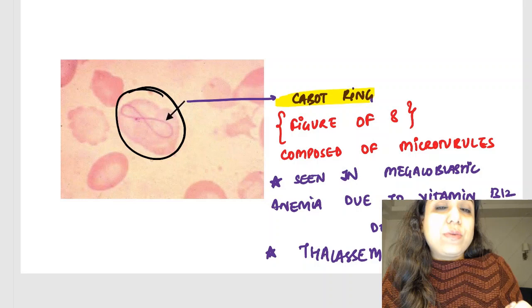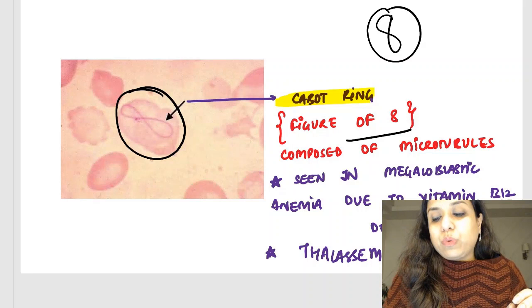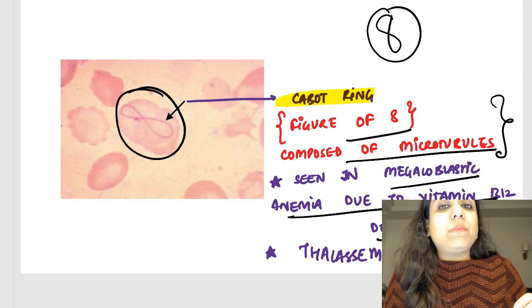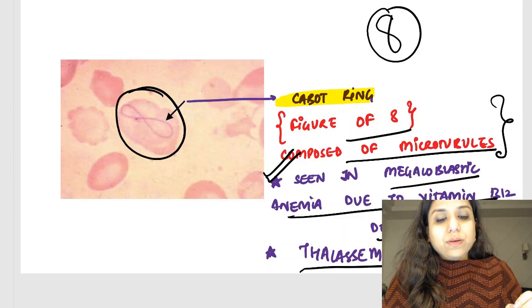This image is a spotter which is quite commonly asked in the FMGE exam. Inside the RBC, can you see something like a figure-of-8 arrangement? This figure-of-8, which is composed of microtubules, is seen in megaloblastic anemia due to vitamin B12 deficiency mostly, and also seen in thalassemia. Best answer is megaloblastic anemia due to B12 deficiency.